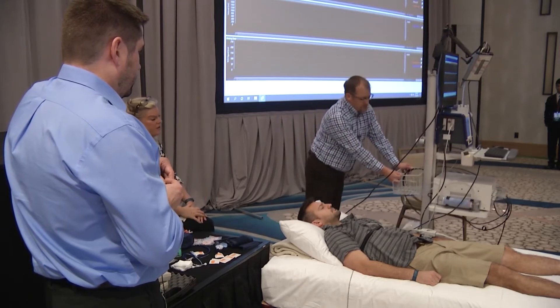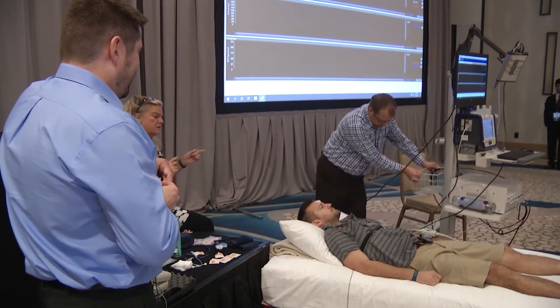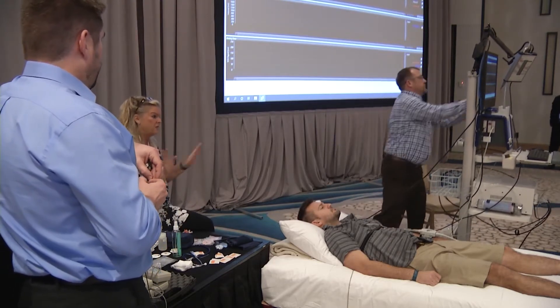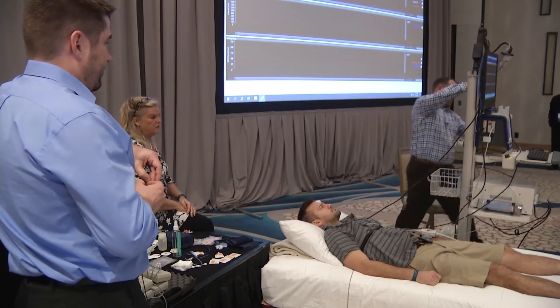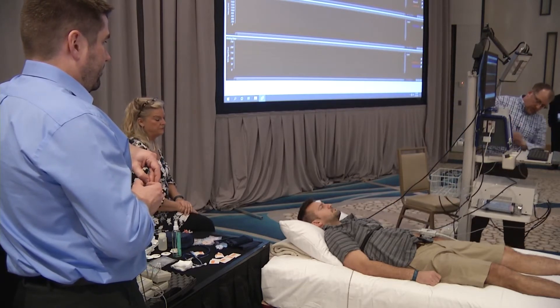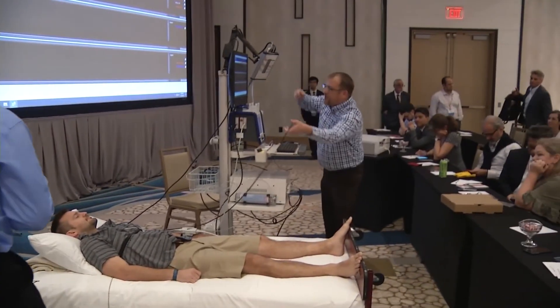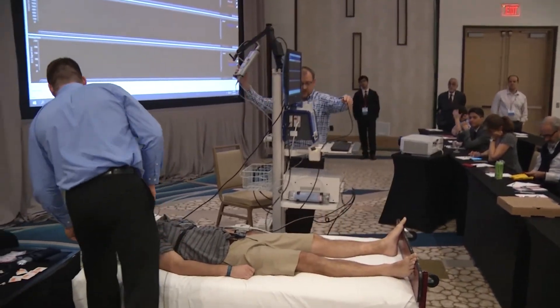If their hands are cold and it takes 20 minutes to get the blood pressure signal, that can happen and add time. And obviously cable management here isn't ideal from our situation, but we'll make it work.